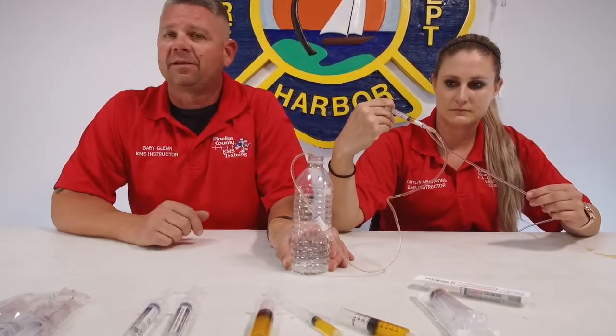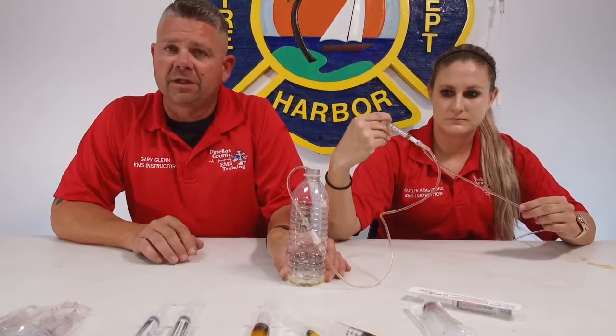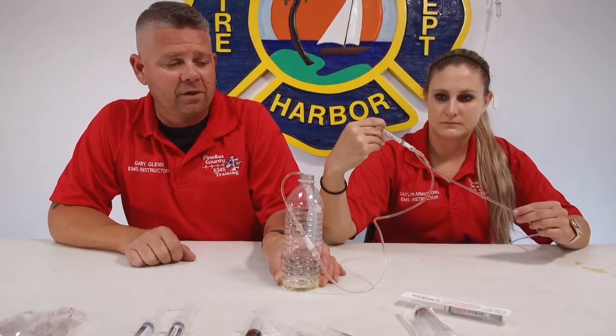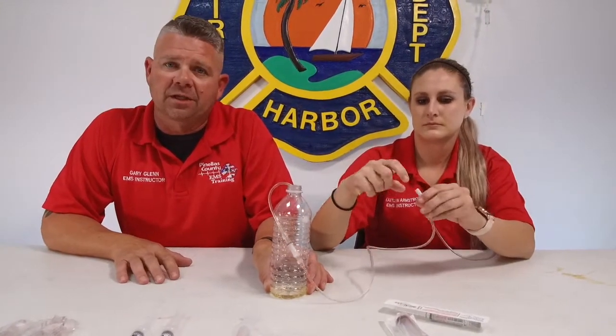So as you can see, the fluid's going down into the patient the way it's supposed to. The medication's being diluted as it goes in, which is exactly what we're looking for. And once the medication is completed, we want to go ahead and flush that medication in as usual.